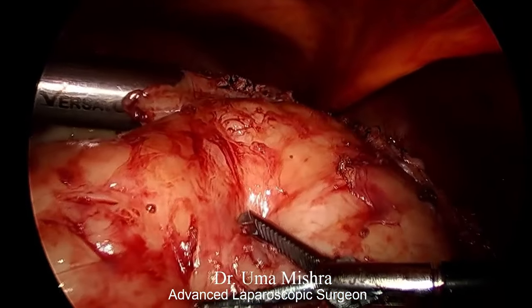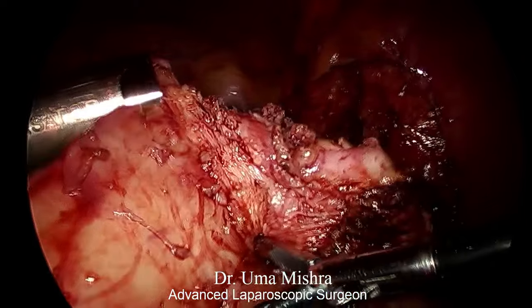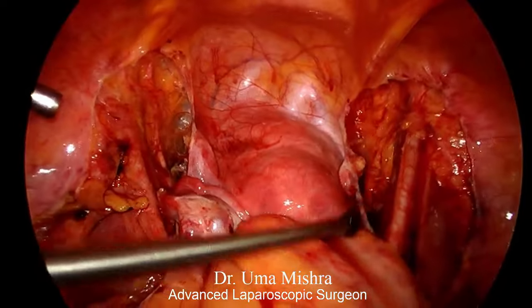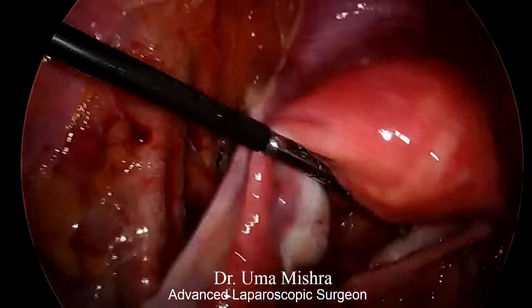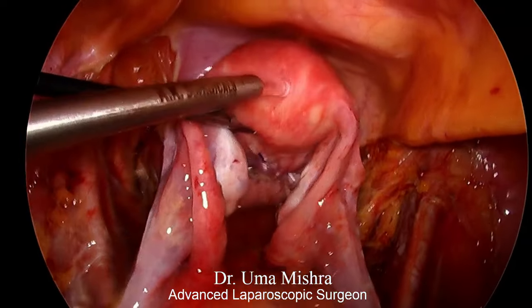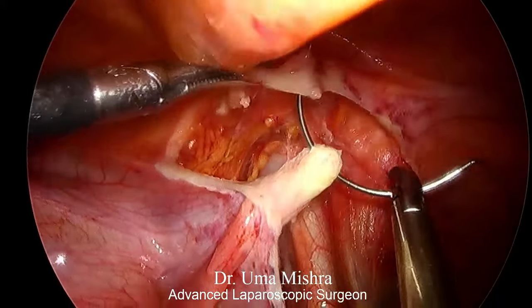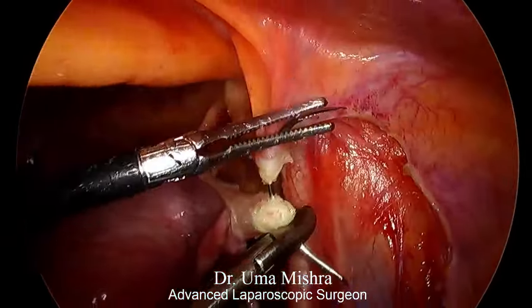So after we morcellate, we don't have to keep even a small chunk of tissue in the peritoneal cavity to avoid future chances of leiomyomatosis. Now we restore the anatomy of round ligament.